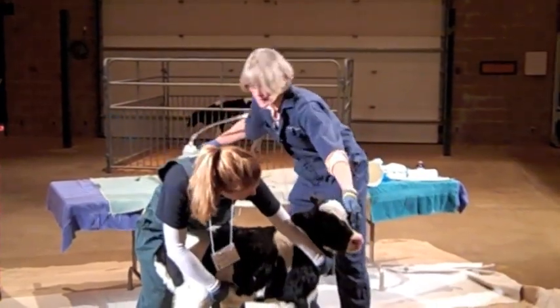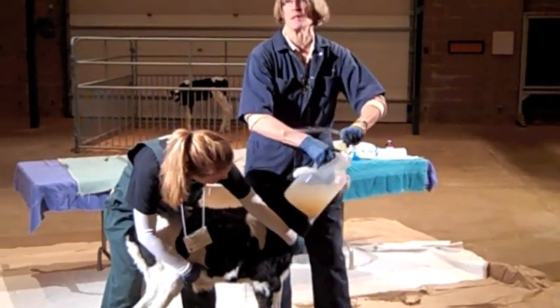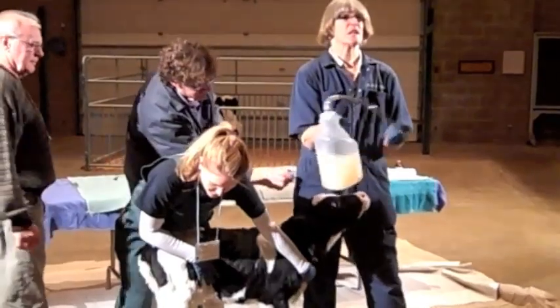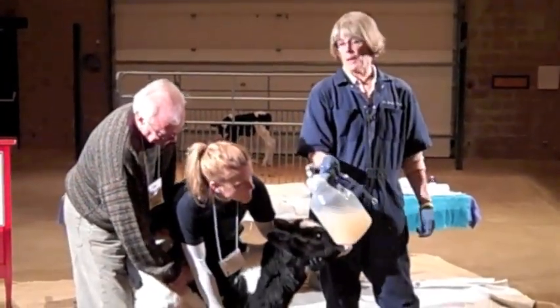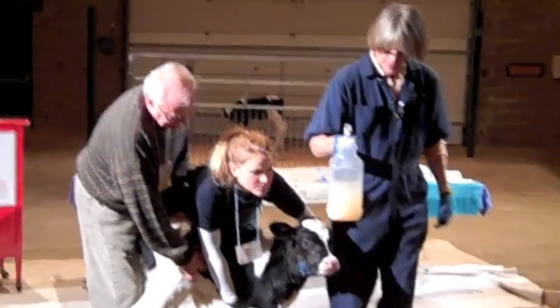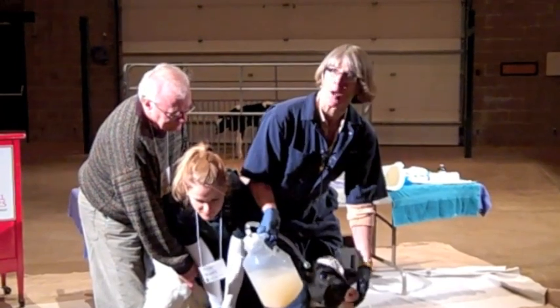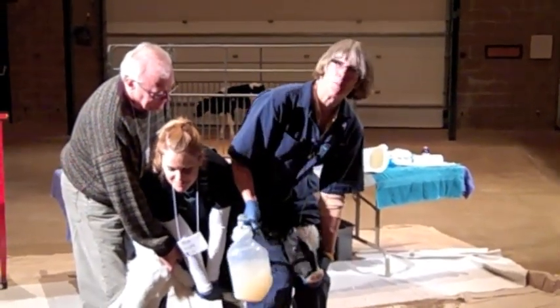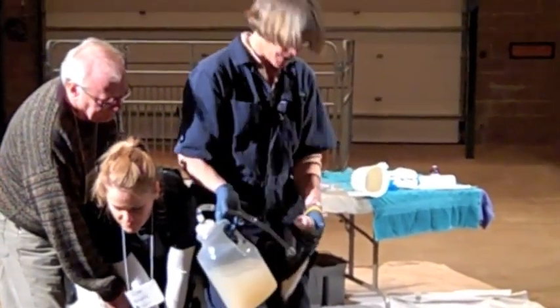The best way to do this is to push their butt into the corner of a pen. I have the advantage of having a little inseam, so I generally straddle calves for things that I do. The left side is probably the easiest side, because the esophagus is kind of on the left side. The most important thing: when you drench calves, use a balling gun, or use an esophageal feeder — this extended head position is not right. If somebody gets in a hurry, this thing becomes a weapon on the back of the throat.